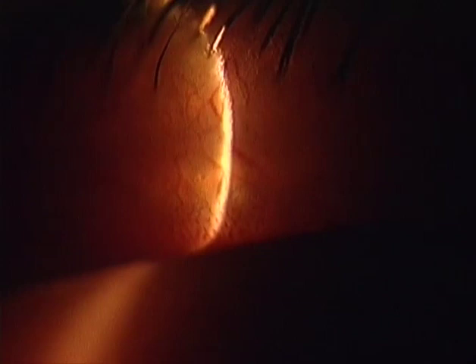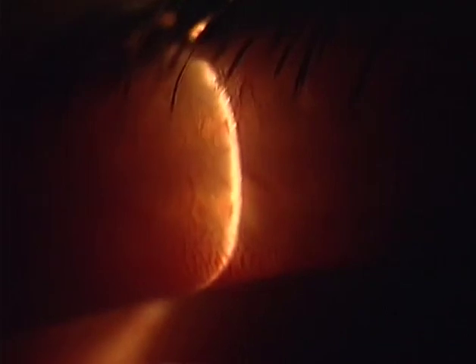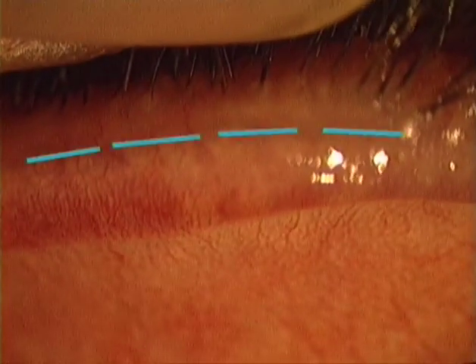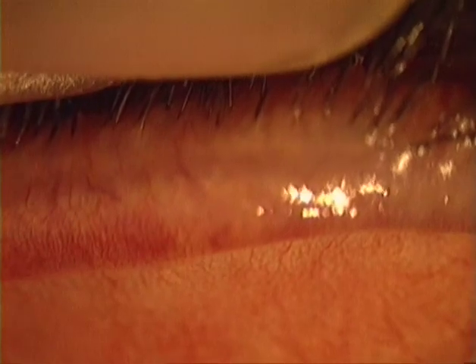If both the ciliary and the tarsal sebaceous glands produce a well-visible sheen, they form two bright yellowish bands at the lid margin. These increase the contrast against the tissue in between, so that the gray line, as seen here in lower magnification, becomes very conspicuous.